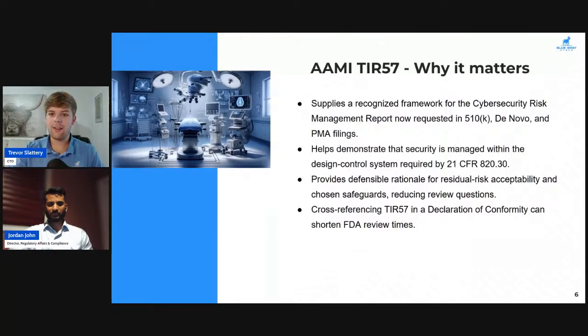All right. Now, I know there are thoughts or concerns about when the module provider pushes a firmware update. If this is for a component that you don't control, essentially it's just going to come down to a matter of business risk, ensuring that you have an approved suppliers list, something that you're going to trust, something that they're going to provide you good content. If this is going to be your own component, then you're going to have to control that level of risk. You're going to have to evaluate the update itself for security and ensure that you aren't pushing out any bad updates, as well as that update process being secure. If you can't control it, of course, you're going to have to ensure that the provider is doing the same thing.